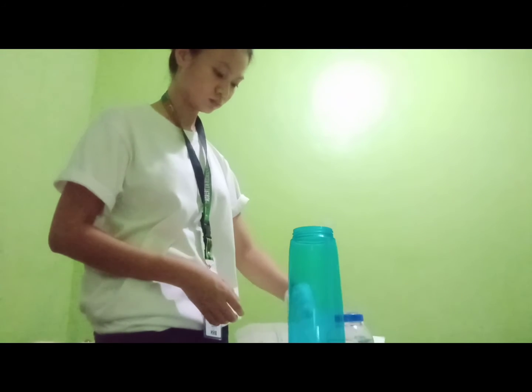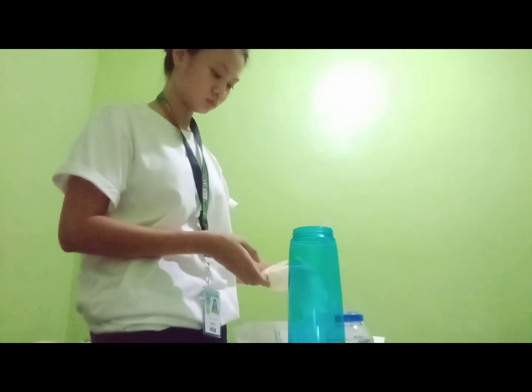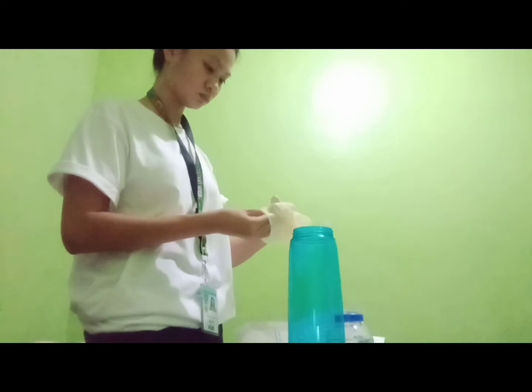Don sterile gloves. If kit provides only one glove, place on dominant hand. Dominant hand will remain sterile. You may use a clean disposable glove on the non-dominant hand to protect yourself from exposure to mucous membranes and sputum.